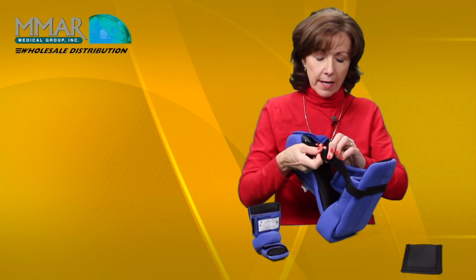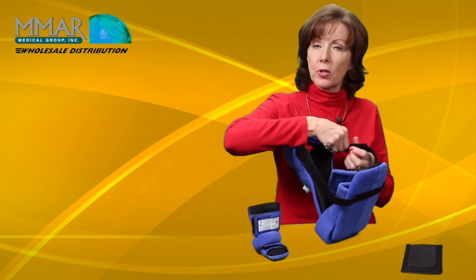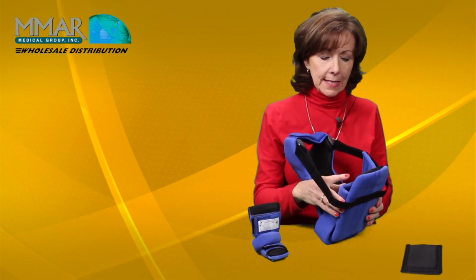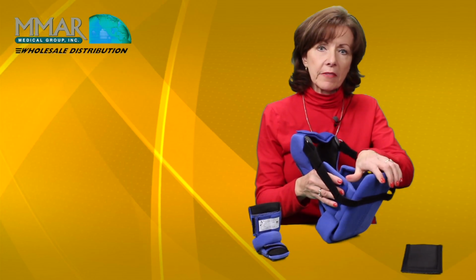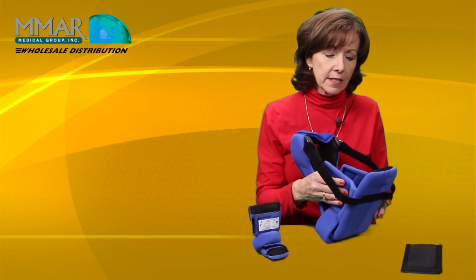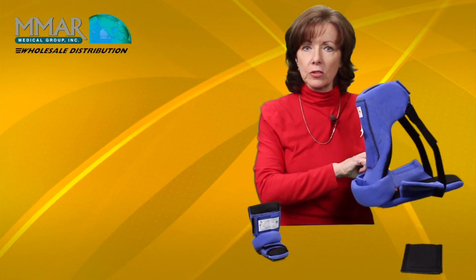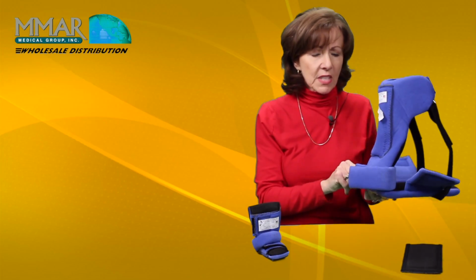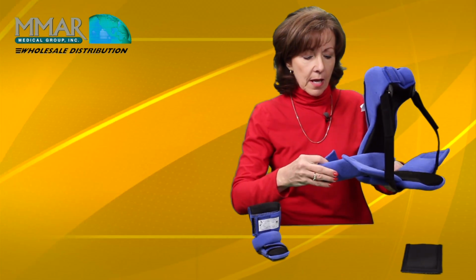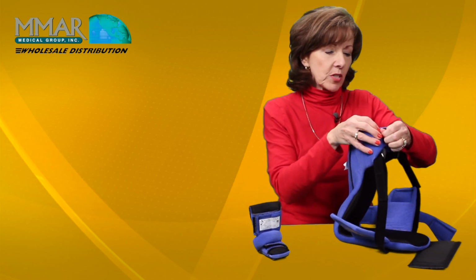I would loosen this up. Once you fit it, then these will stay the same until a therapist or the appropriate person, the orthotic fitter, redoes these. Orthotic fitters fit by far the majority of restorative contracture devices. They're specially trained for that, and they're very good at it, and they understand the neurological component of these patients, unlike orthopedic. So I'm going to open the flap that goes over the foot. I'm going to open the talus strap, and I'm going to open this.